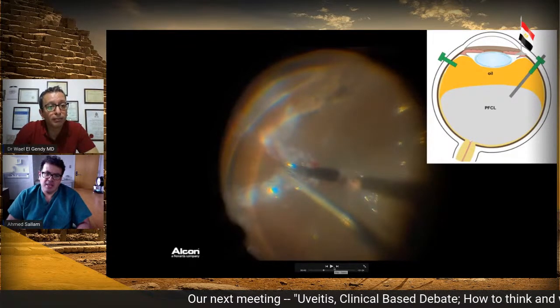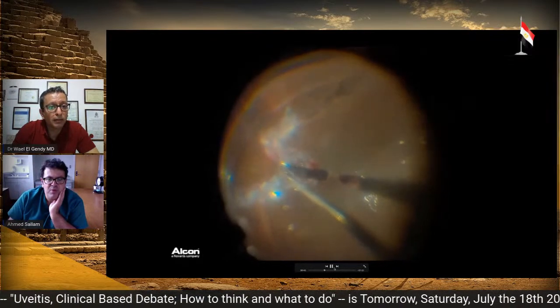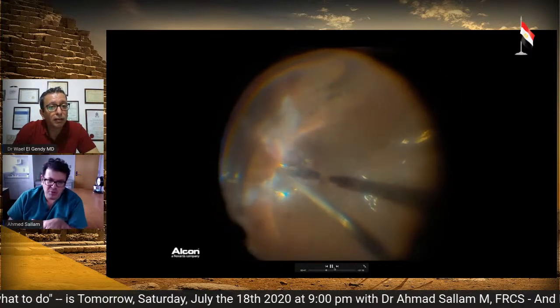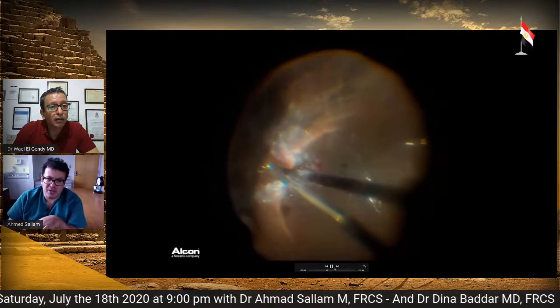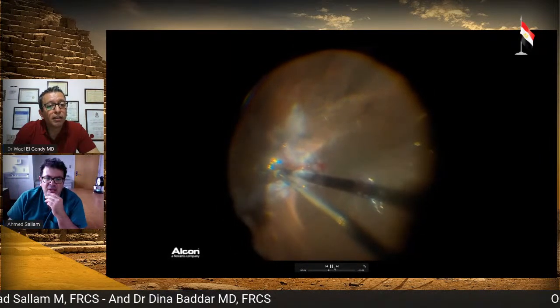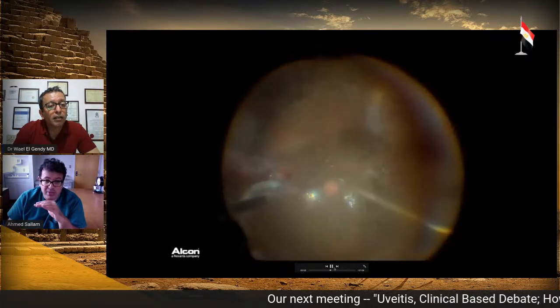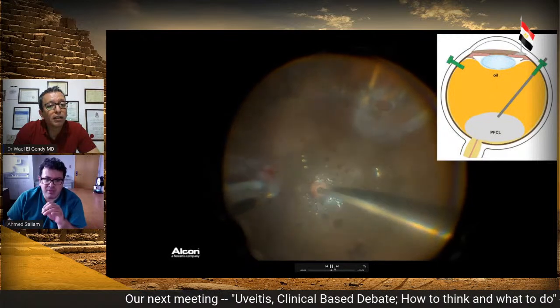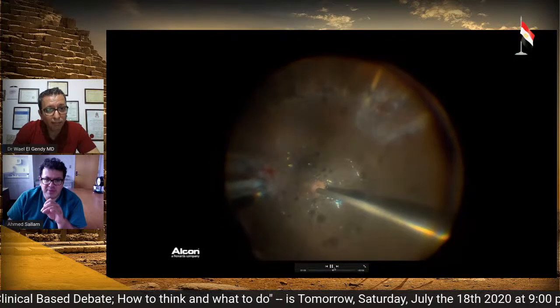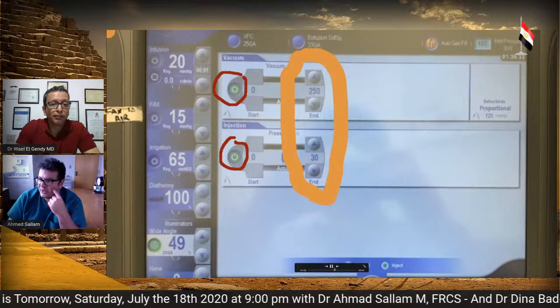Okay, that's nice. So here I'm now removing the PFCL and the BSS, and if you do it correctly, slippage just does not happen under oil. It just does not happen. And then here, the oil is being injected. The backflush or the extrusion here is always in the BSS or the PFCL. And let me show you how it happens from outside.